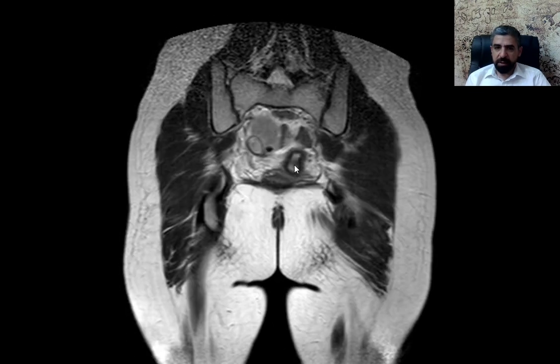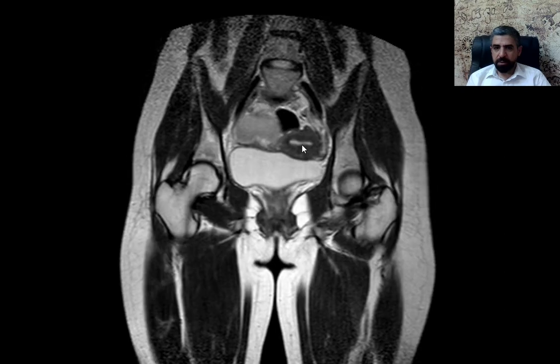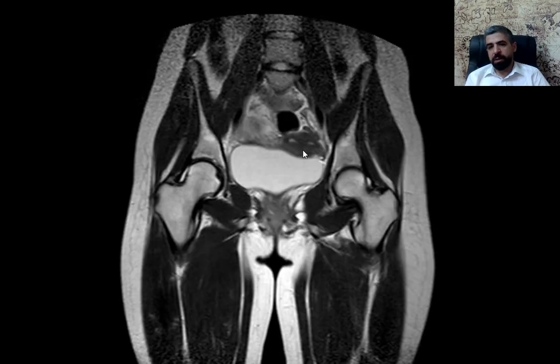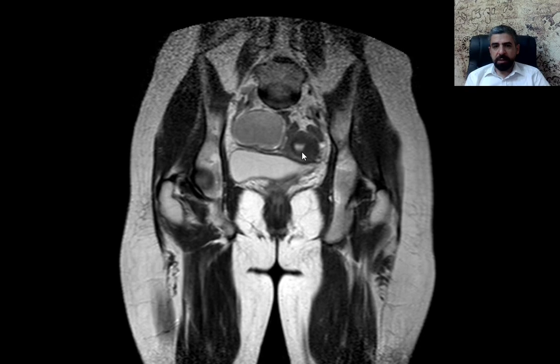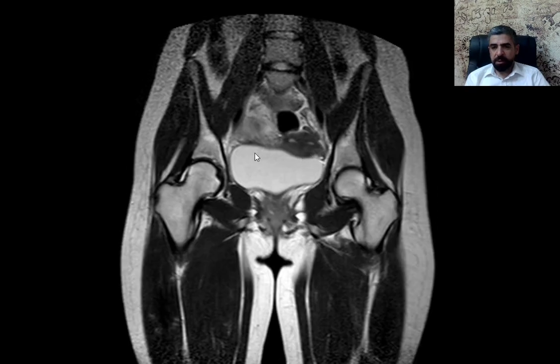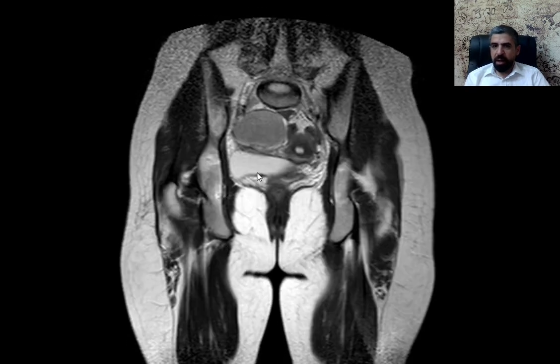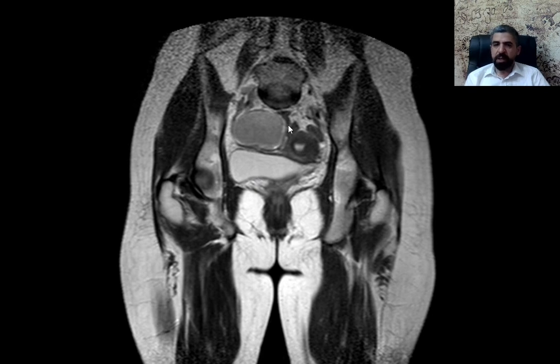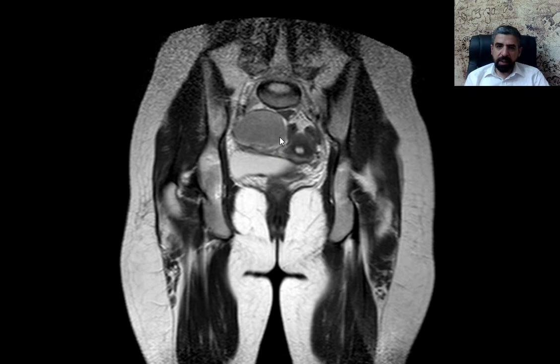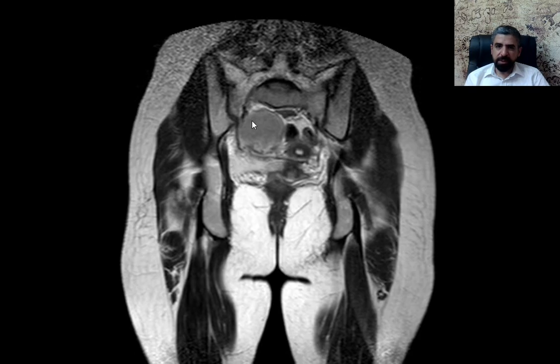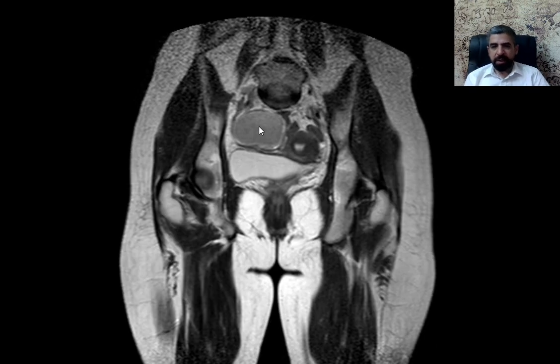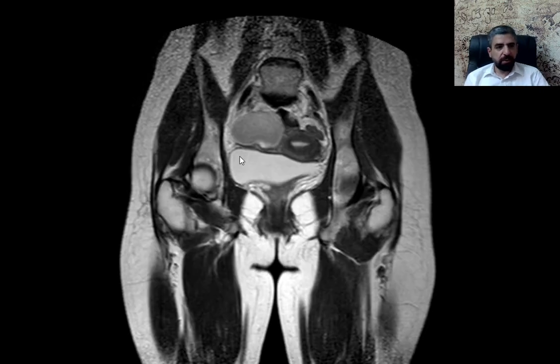This is the cervix here, going on to the uterus, and the urinary bladder looks basically normal. And what is that? This is the mass reported on the ultrasound. On the T2-weighted images, the mass is somewhat hyperintense — not as hyperintense as the urinary bladder, but some sort of hyperintense.